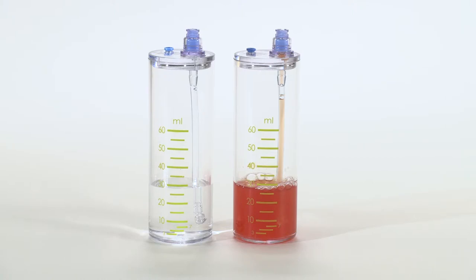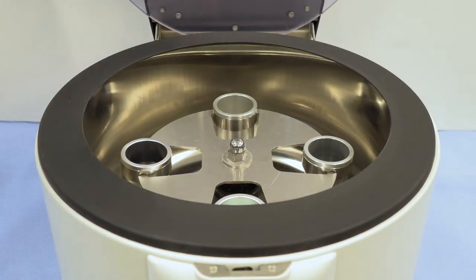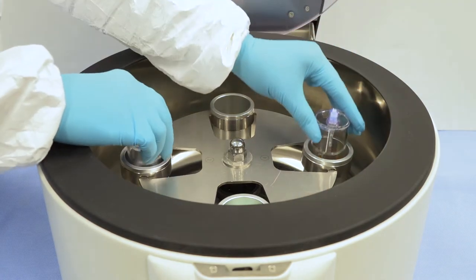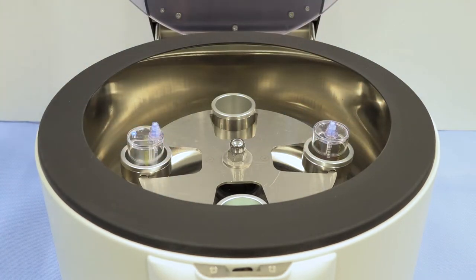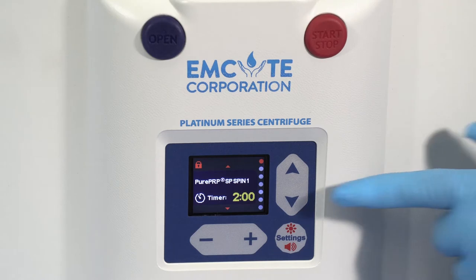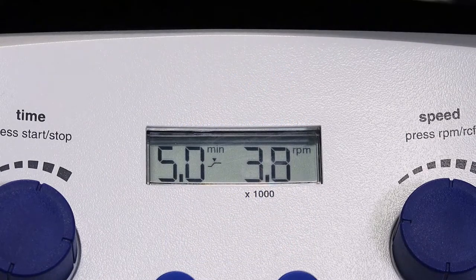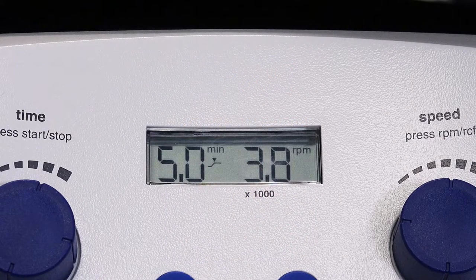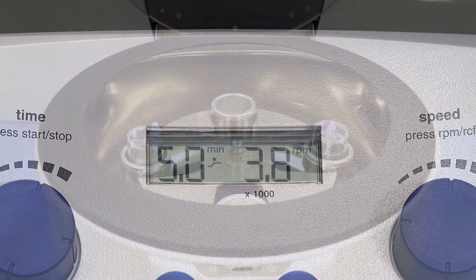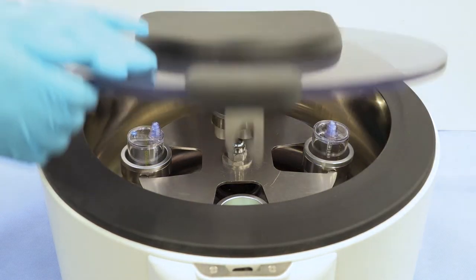Counterbalance the accessory with equal volume and place back into the centrifuge rotor at opposite ends. Set the Platinum Series centrifuge at Pure PRP SP SPIN 2, or set the Executive Series centrifuge for 5 minutes and 3800 RPMs. Close the centrifuge lid and press Start.